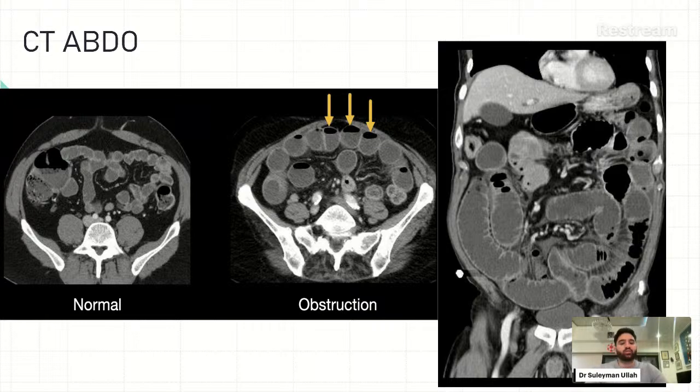So what the radiologist would usually do is look through it, follow and track all of the bowel, look for the point of obstruction, and then that would be relayed to the surgical team, who could then look into that when they open the patient up for surgery.